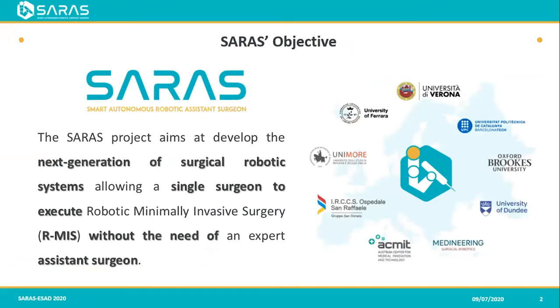First of all, the SARAS project will allow the next generation of surgical robots to execute minimally invasive procedures with only the main surgeon, without the need of an assistant. Through the collaboration of 9 European partners, including universities, hospitals, and small medium enterprises, SARAS will develop a new robotic system consisting of a pair of cooperating robotic arms holding the laparoscopic instruments.